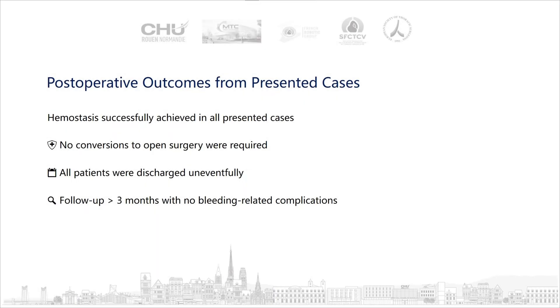We can see that hemostasis was achieved in all presented cases with no conversions to open surgery and no bleeding-related complications.